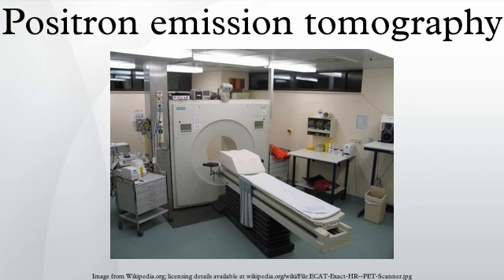Much more commonly, however, drug occupancy at a purported site of action can be inferred indirectly by competition studies between unlabeled drug and radiolabeled compounds known a priori to bind with specificity to the site. A single radioligand can be used this way to test many potential drug candidates for the same target. A related technique involves scanning with radioligands that compete with an endogenous substance at a given receptor to demonstrate that a drug causes the release of the natural substance.